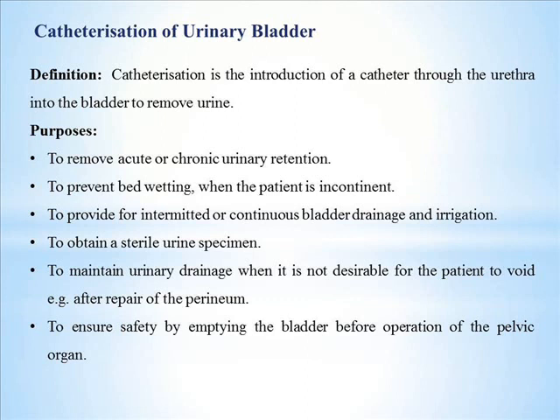We'll see the purpose. The purpose is number 1, to remove acute or chronic urinary retention. Number 2 is to prevent bedwetting when the patient is incontinent. Number 3 is to provide for intermittent or continuous bladder drainage and irrigation. Number 4 is to obtain a sterile urine specimen.